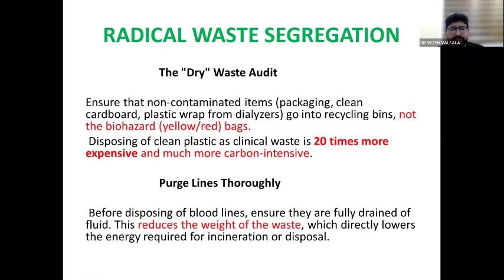Purge the lines thoroughly. This means that before disposing of the blood lines, you ensure they are fully drained of fluid. Sometimes the dialyzer has some fluid inside and it is not fully flushed out, and you put it in the waste bag. When it goes for incineration, the amount of incineration is set based on the weight of the waste. So when there is water inside the dialyzer, its weight will be more than one which is purged completely and dry.